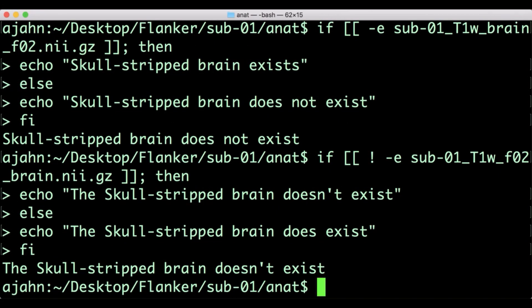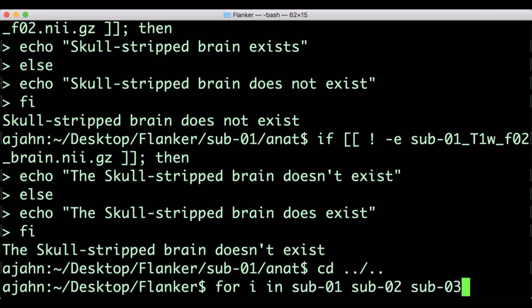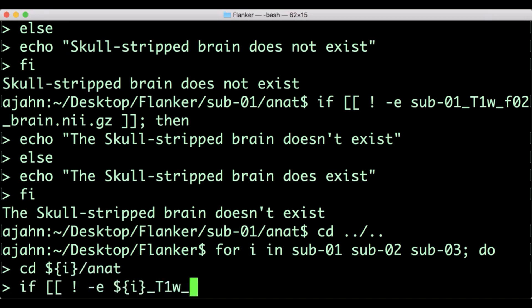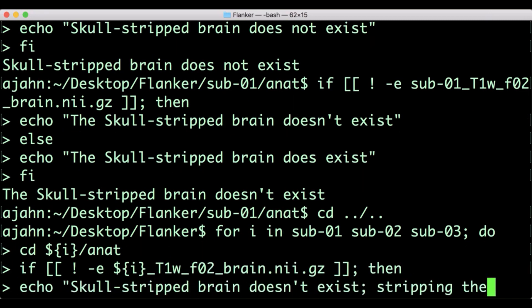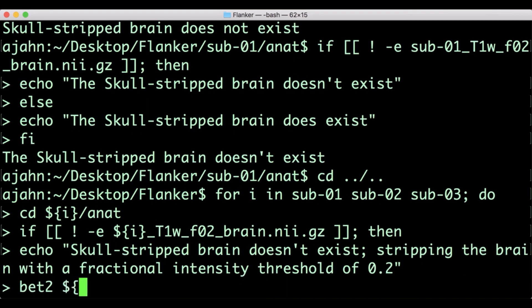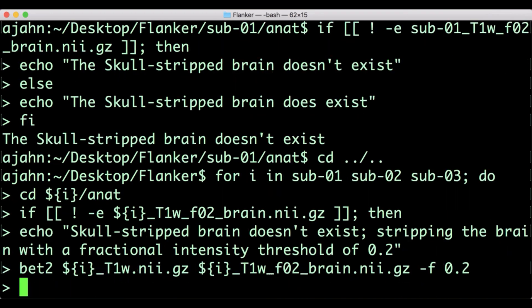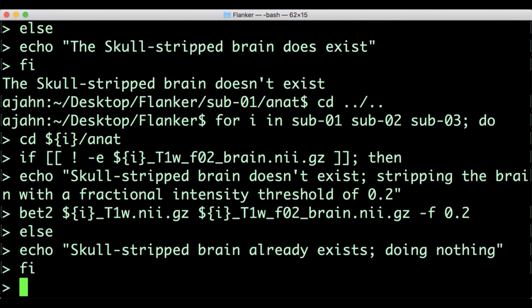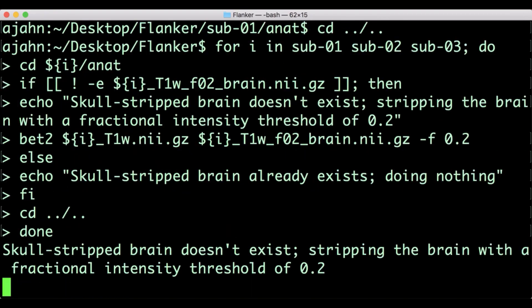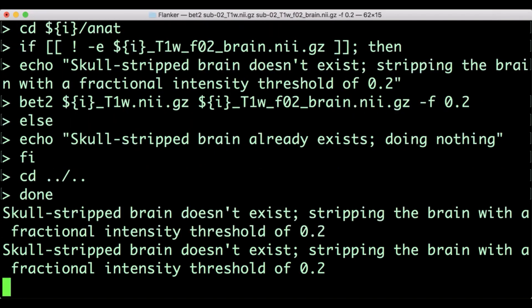Let's finish with a demonstration of how to combine a for loop with a conditional statement. Let's say that we want to check whether subjects 1, 2, and 3 have a skull-stripped anatomical image. If it doesn't exist, strip the skull using bet2. Navigate to the directory containing all of your subjects, and then run the following code, which you can also find in the more info box down below. This will navigate into each subject's anatomical directory and check whether the skull-stripped image exists. If it doesn't, then it runs bet2 in order to skull-strip the anatomical. The echo commands are optional — I like to include them so that the user knows which command is currently being run.